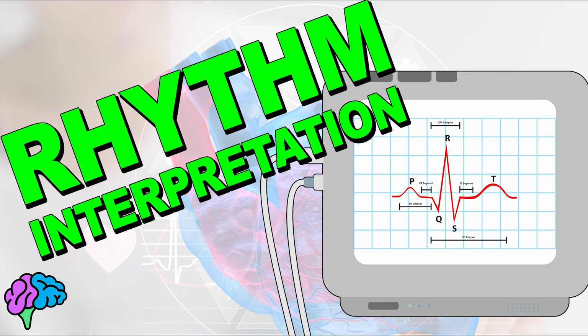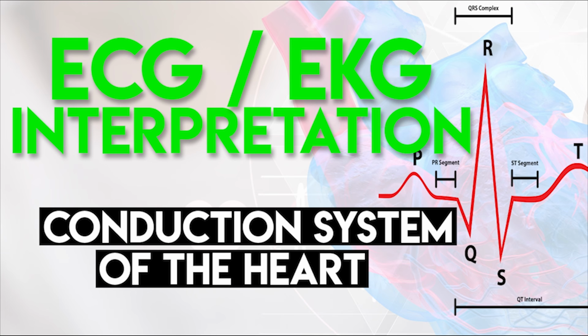I hope you guys enjoy this master cut on building a solid foundation in rhythm interpretation that's really essential for you to know.